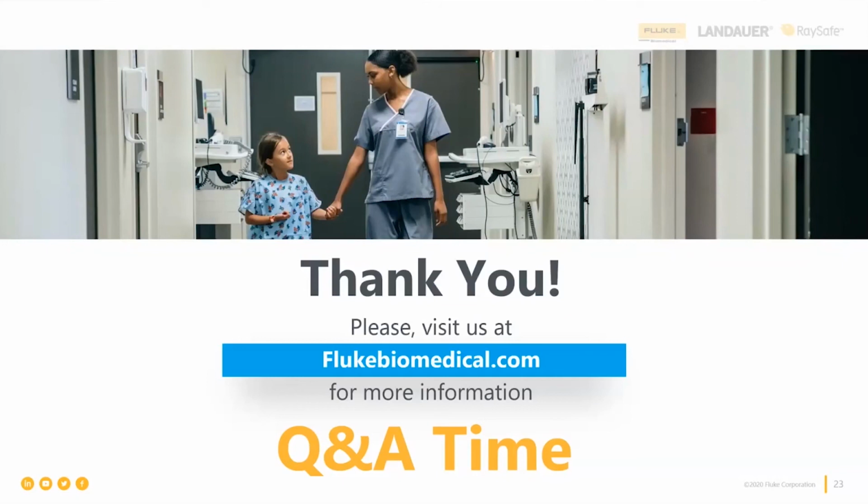Even the capacitors in defibrillators have very long life. Yeah. Even your defibrillators that sit on the cart and plugged in all day long, those batteries can go bad. You should never let a battery sit in the charger 24/7 without exercising it. Exercise that battery and make sure that it will hold a charge when you need it.